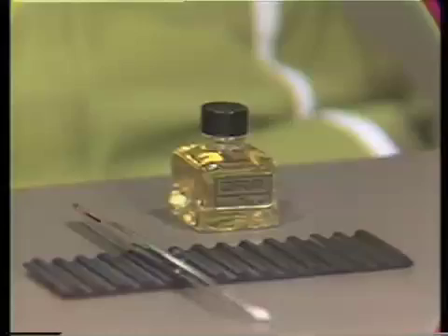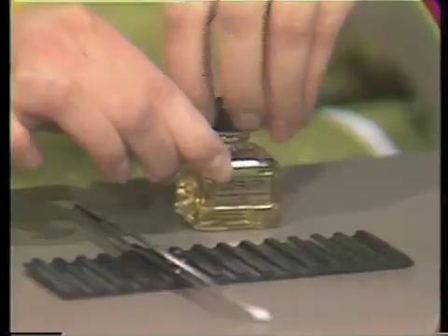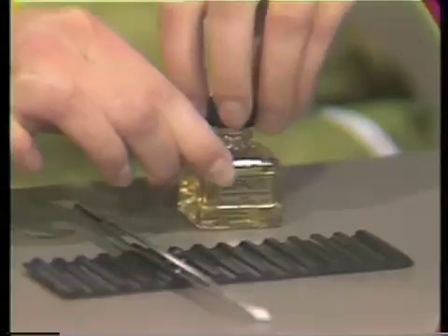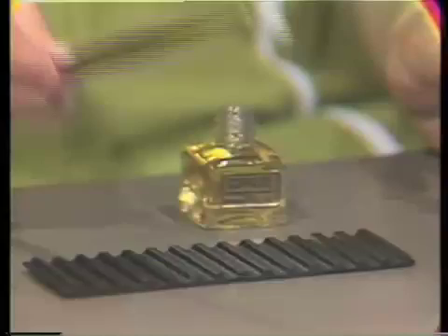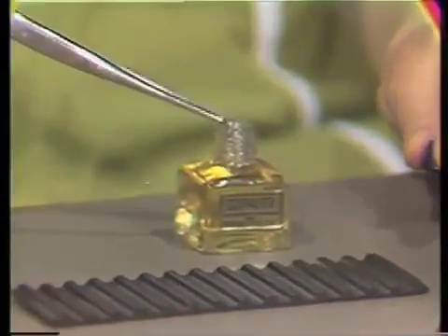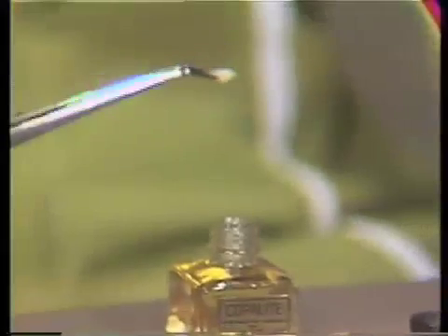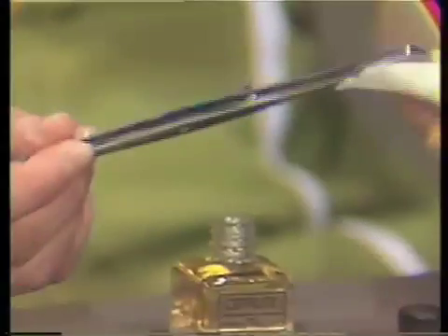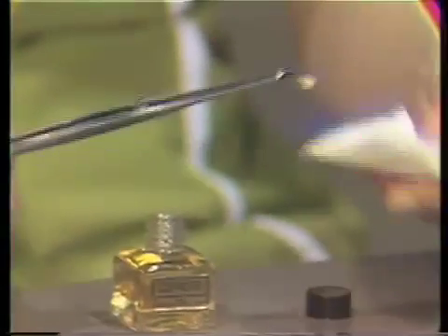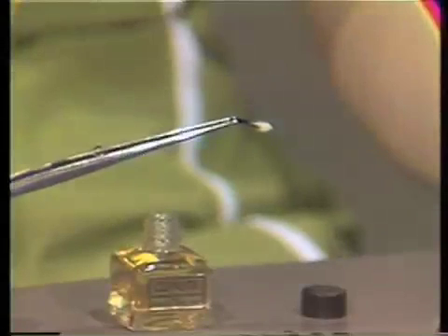To apply Copalite, insert a clean cotton pellet into a pair of locked forceps, as has been done here, and place the pellet into the bottle of Copalite. Blot well to remove any excess, and the varnish is then ready to be applied to the cavity preparation.